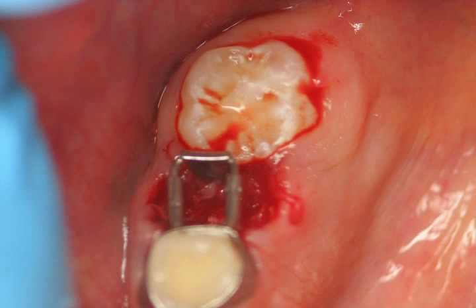This photo is showing the distal shoe space maintainer placed in the mouth. Notice the ring or band portion glued around the tooth in front of the one removed and the shoe part of the space maintainer next to the permanent molar to guide it into the mouth more correctly.